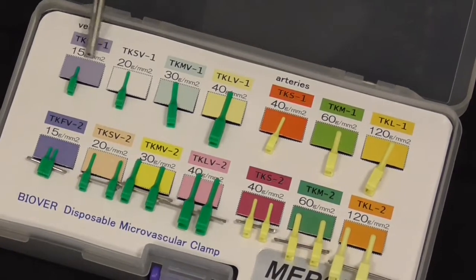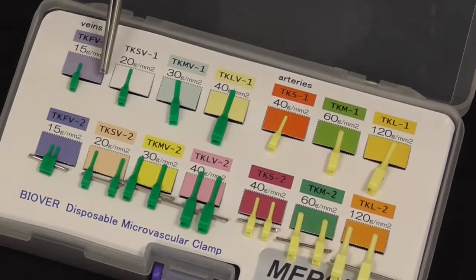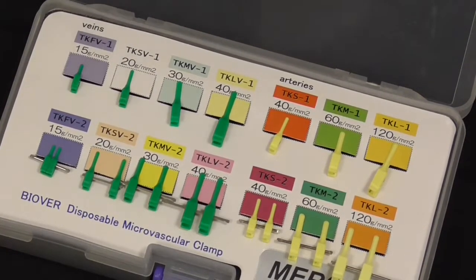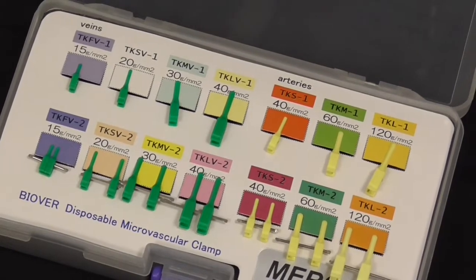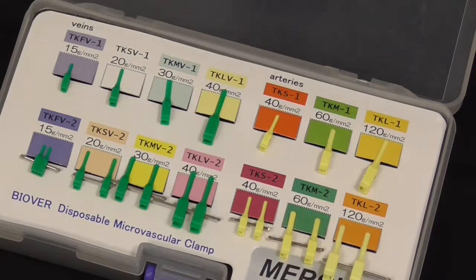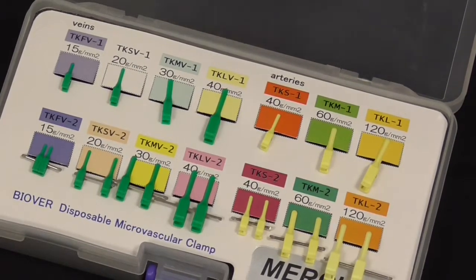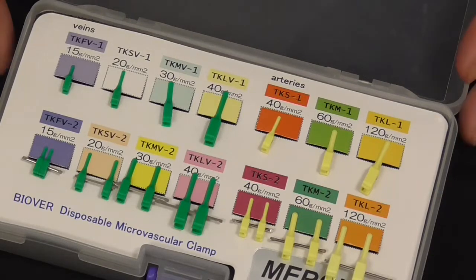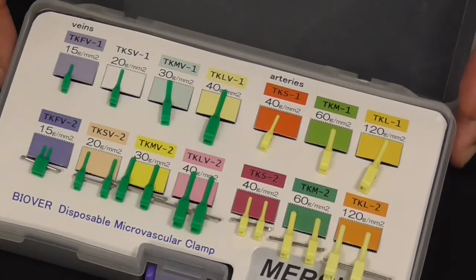If you had 15 grams per millimeter squared, the pressure given to a small vessel would be a lot more than for a larger vessel. That's why we use the smallest clamps we can per vessel. Veins are more prone to injury than arteries, so you want to use less closing pressure.